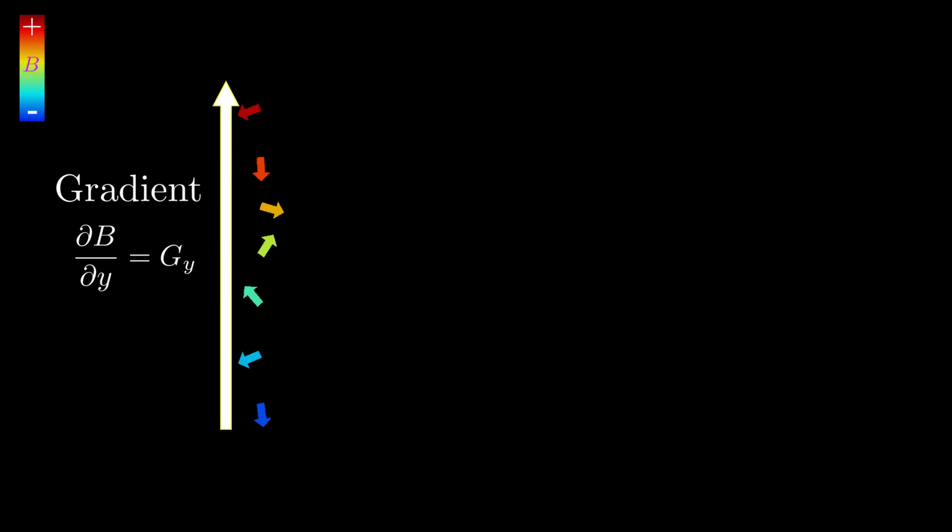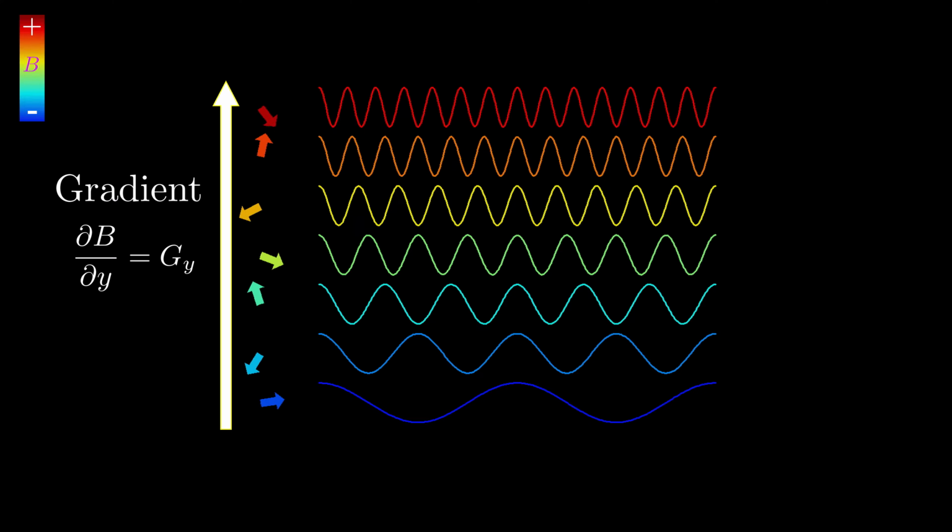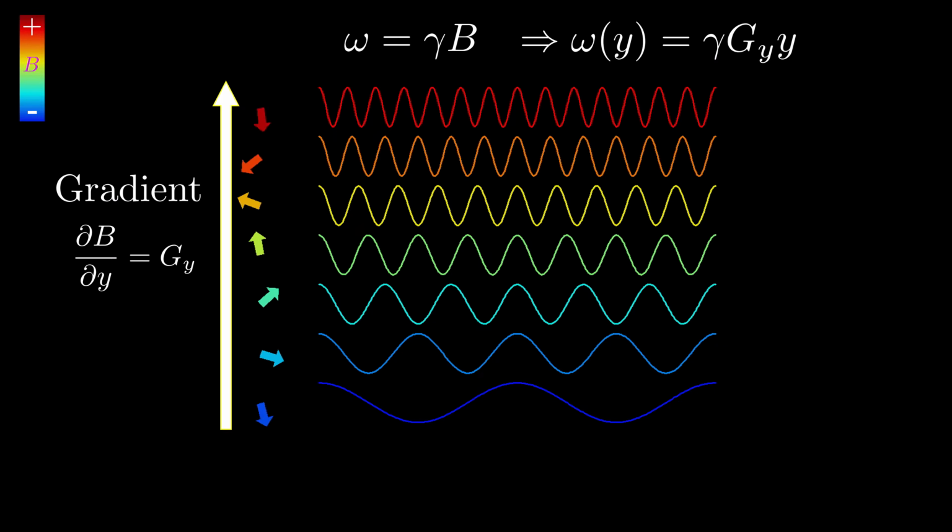Well, since they're all in different magnetic field strengths, they all exhibit different frequencies. That's how we're going to localize spins in space and produce images. Different frequencies come from specific locations in space. But there's a problem, right?